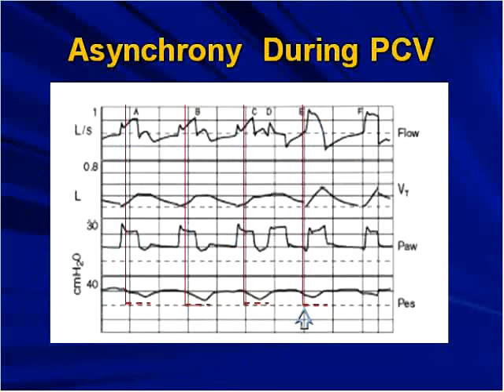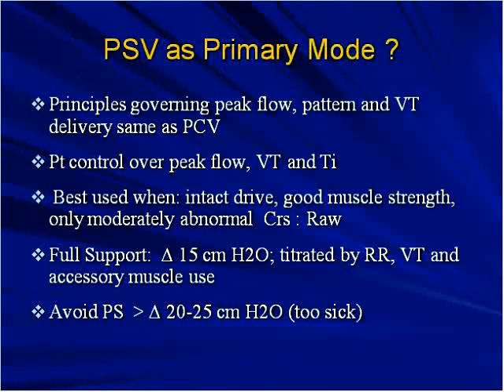very surprisingly, that the work of breathing actually was somewhat higher in pressure control than volume control using ARDSNet. It wasn't statistically different, it wasn't really huge, but it was a surprising finding. So automatically switching someone to a pressure mode, particularly during lung protective ventilation, doesn't necessarily mean their work of breathing is going to be better.